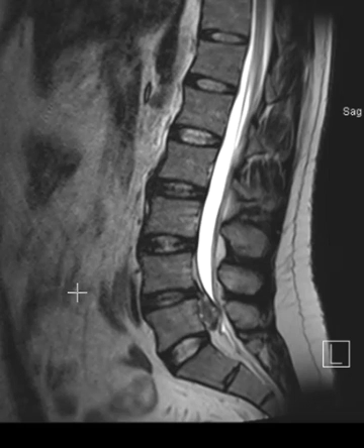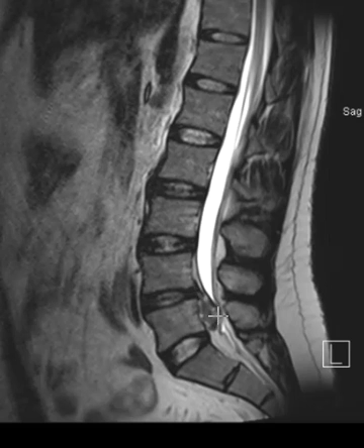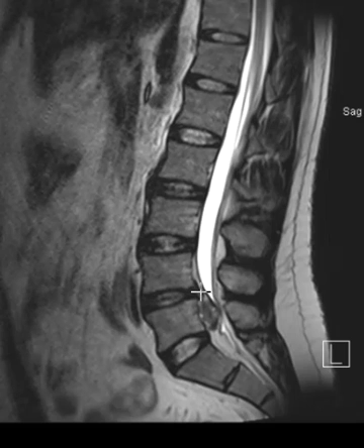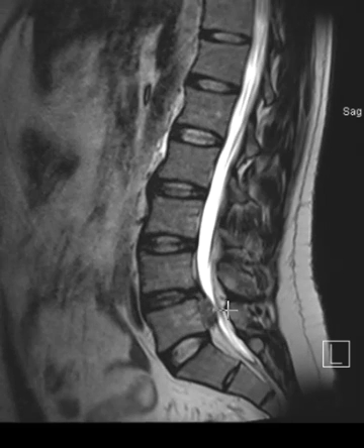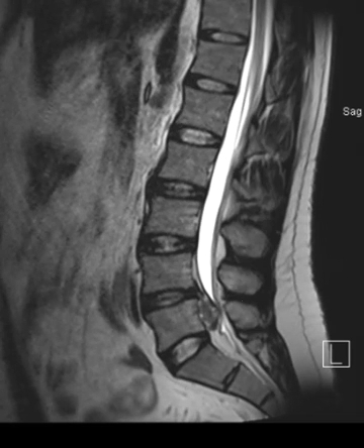This is another patient, almost the same age as the last two — pretty young again. We see these vertebral bodies, we see the discs here in between, and we see something extra here: a disc herniation that's squirted outward and going down like toothpaste going down into the spinal canal. The last patient had one that was straight at the disc level; this one has extruded out and gone downward, and again this fills the spinal canal on the right-hand side and causes severe narrowing of the spinal canal and pinching of the nerve roots.